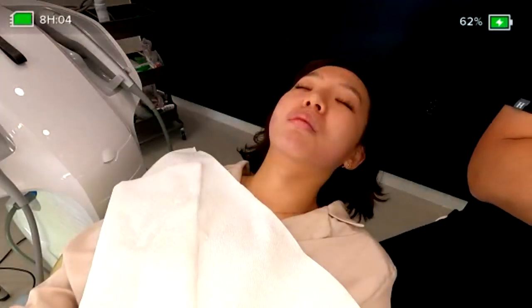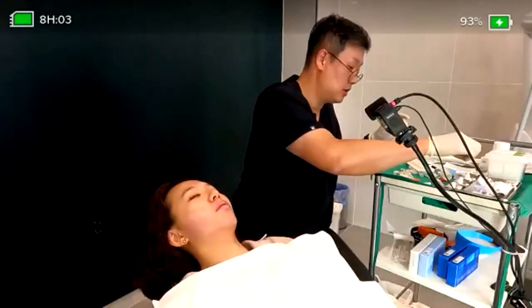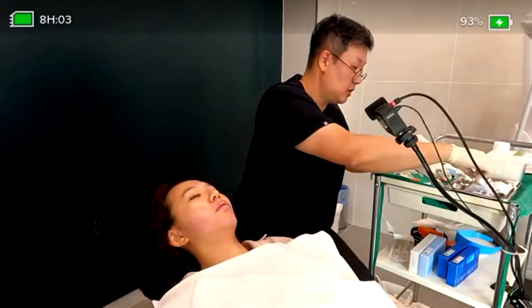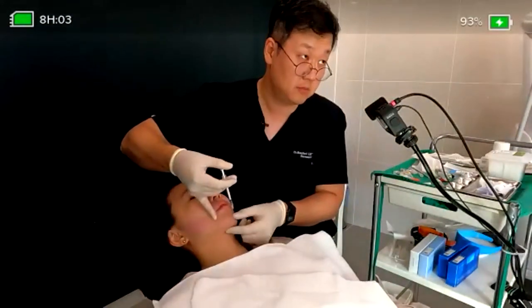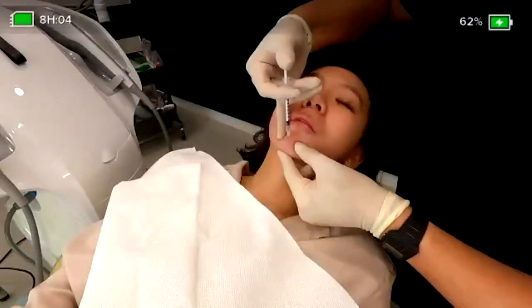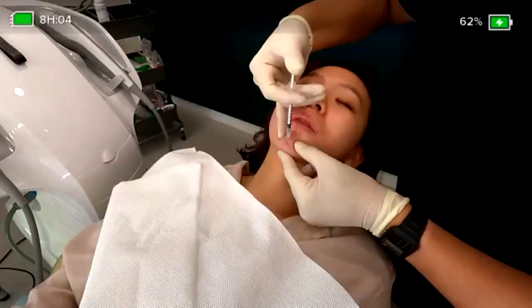I'm using the cannula injection and the needle injection together. So today we will go for the chin. We will make a from this direction because the camera angle is much better here. So we'll make an injection here first.